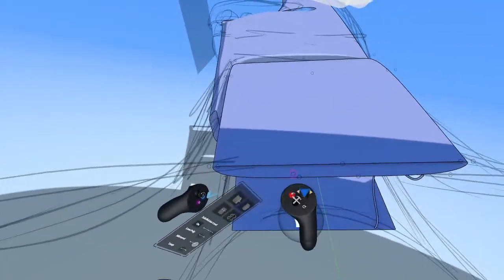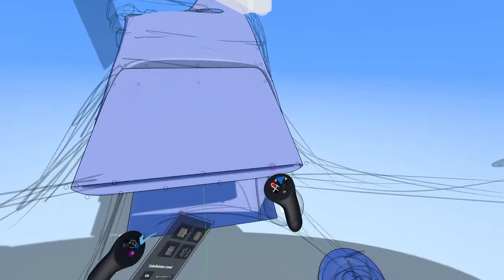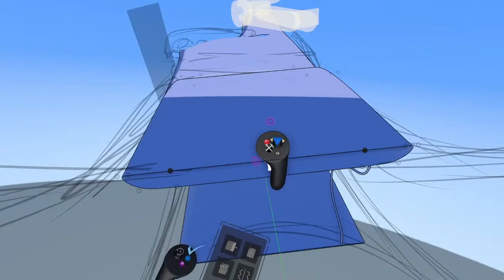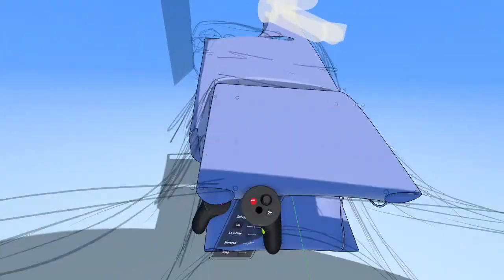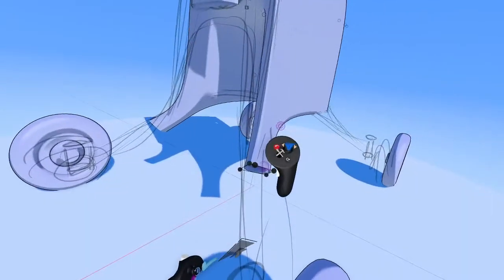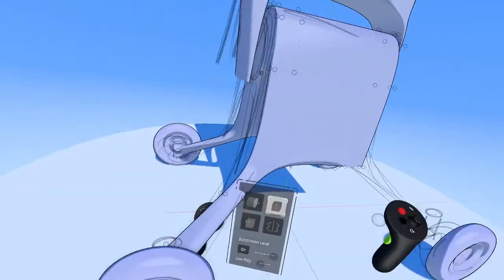All right, just gotta figure this out. Okay. Here's what I'm gonna do. I'm gonna drop in two points like this, and then select Auto Edge Loops and delete these inner points that I made earlier. And now grab just this edge and connect the middle part here, and then use this little hole that I have here to shape the legs here. So I'll turn on Auto Edge Loop and grab this loop, press the pointer finger trigger, and duplicate it out like this. And I'll just stretch it out like that. We'll do the same thing up here.